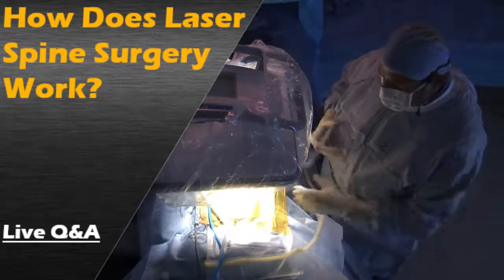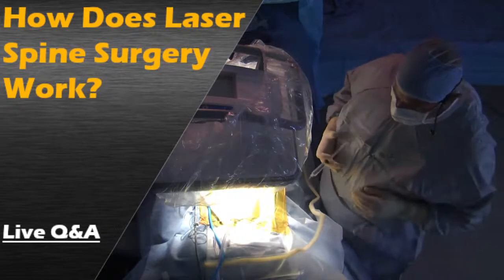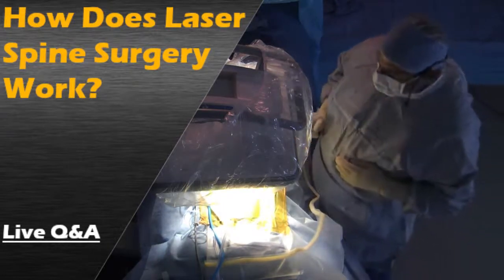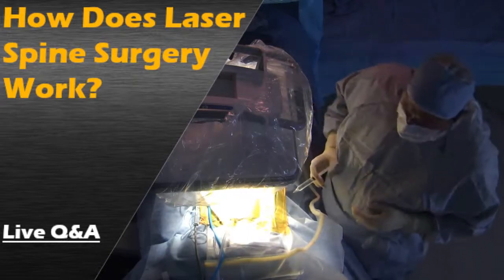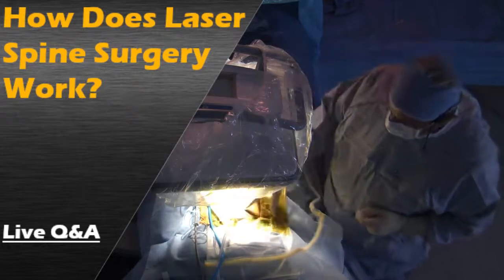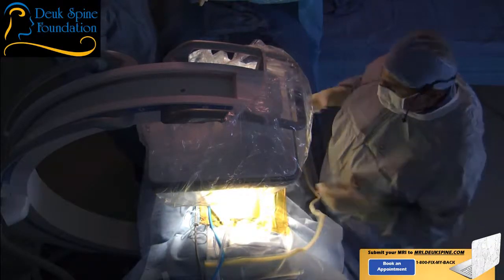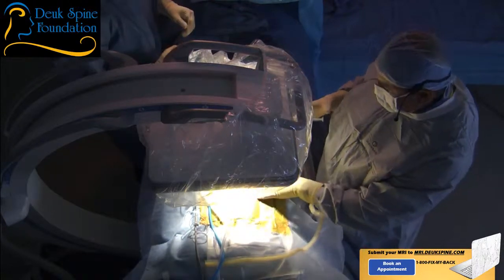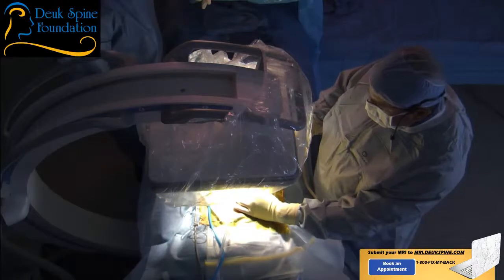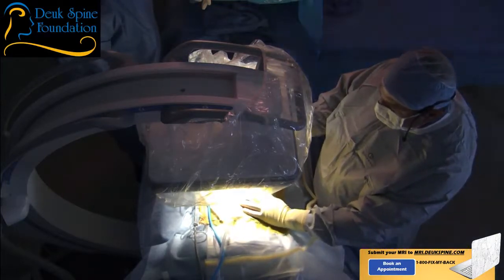Dr. Duke Majian checks in with the patient: 'Are you okay? Are you comfortable?' He then administers local anesthesia: 'You're going to feel a little stick and burn — that's the pain medicine going in to numb things up, just like at the dentist's office. We'll give it a minute to work and then get started. If you feel pain throughout the procedure, just say ouch and I'll give you more medicine.'